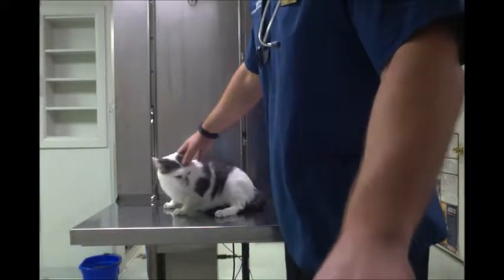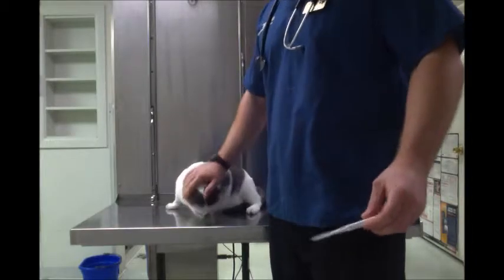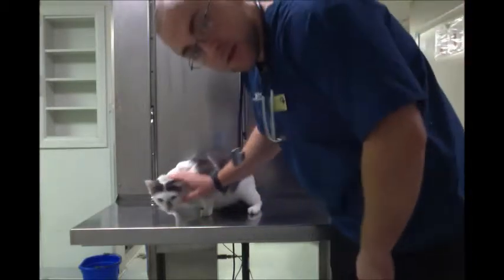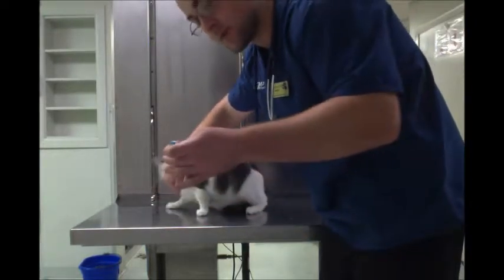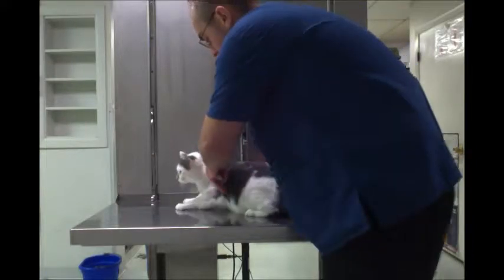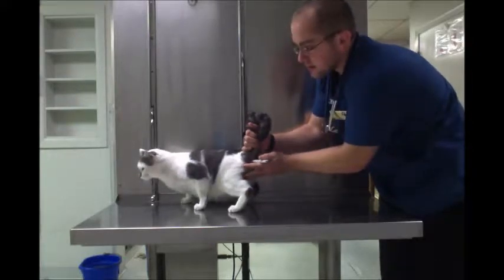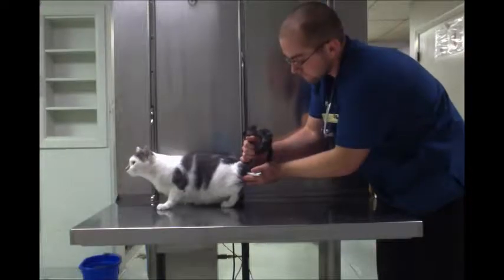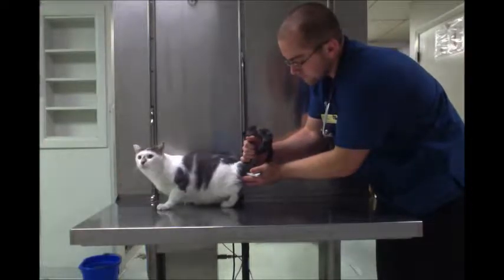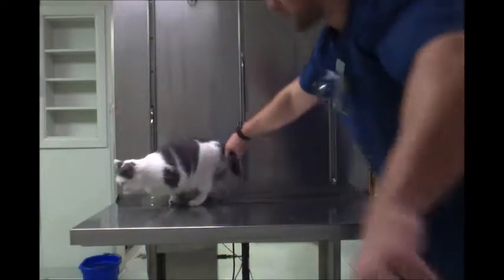Alright, I'm going to go ahead and examine Jersey here. He's a cat. We're not actually doing anything to him today, but I'm going to get his temperature and listen to his heart and lungs just like we would for any kind of anesthetized procedure. So I'm going to start with his temperature. Good boy, Jersey. His temperature is 101. That's very good.